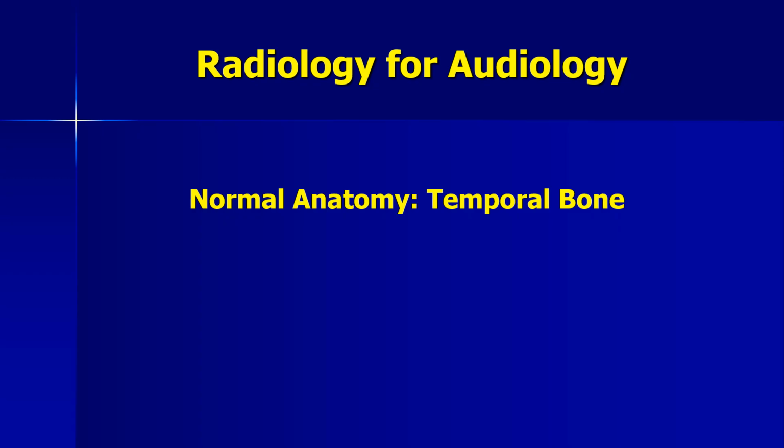So now let's shift our focus on the imaging. I will briefly go over the basic normal anatomy and appearance of the temporal bone on both CT and MRI imaging. And after that, we will look at several clinical cases with abnormal imaging findings.